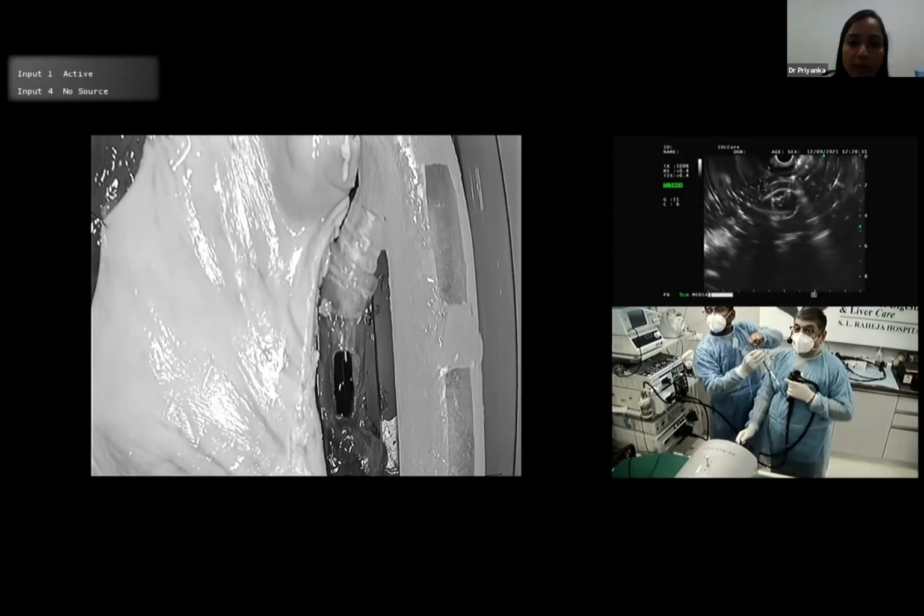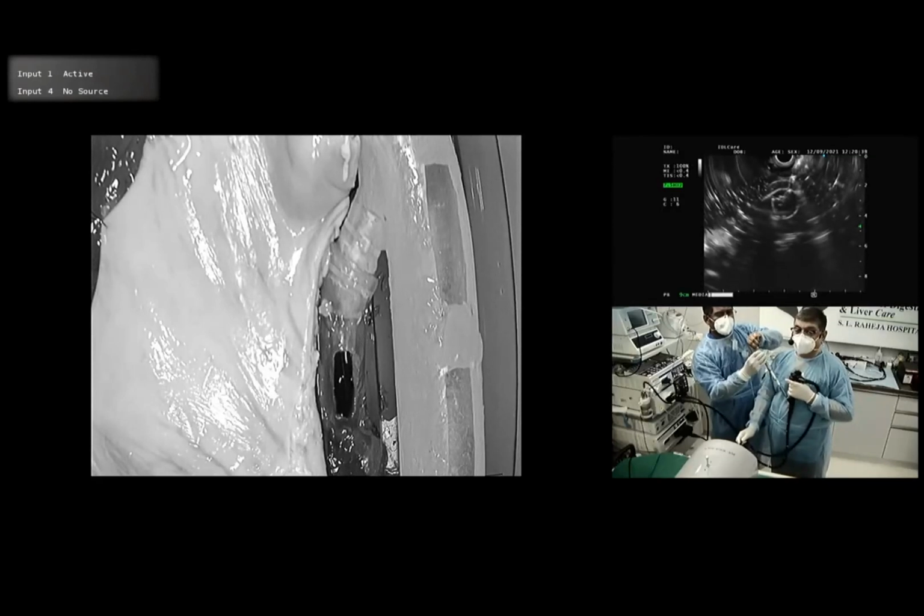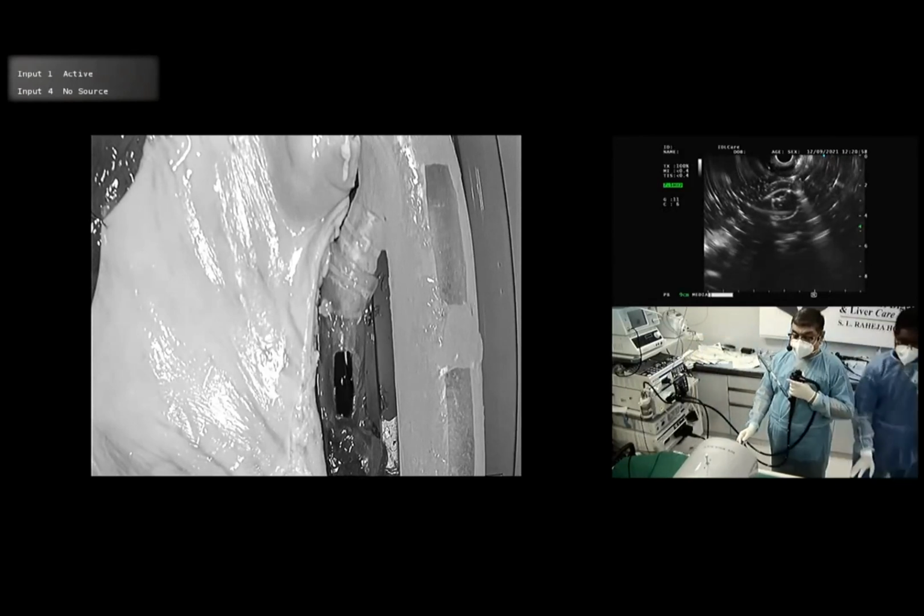So Dr. Raval is asking which wire we should use, Terumo or VisiGlide from the beginning. We love Terumo, but VisiGlide is equally good. So we use a J-tip Terumo. Don't try, it will not go. No, let us see what has happened on fluoro. The table needs to be shifted a little. So we are putting on the fluoro. Give us 1 minute.